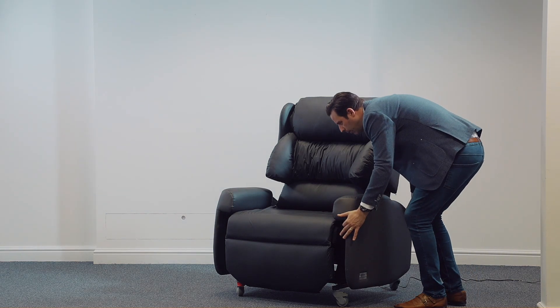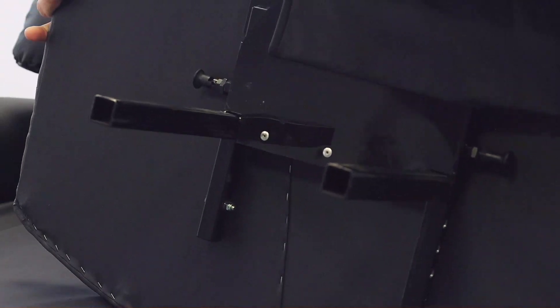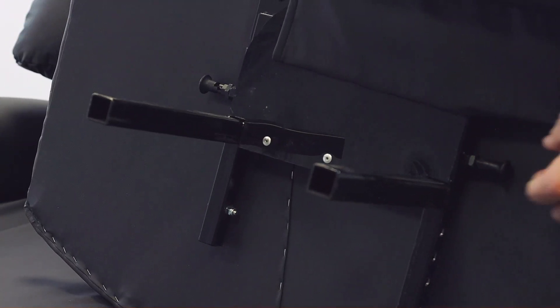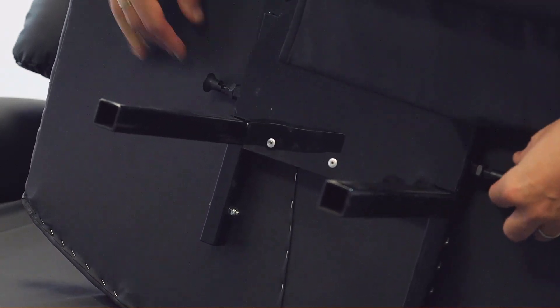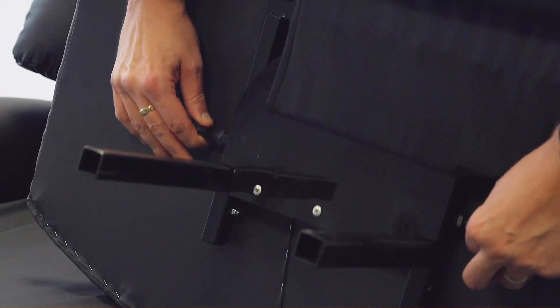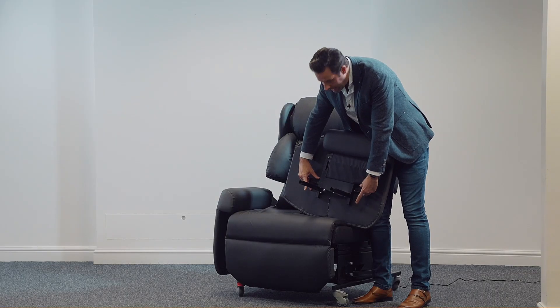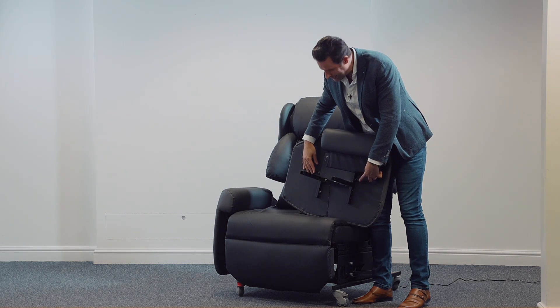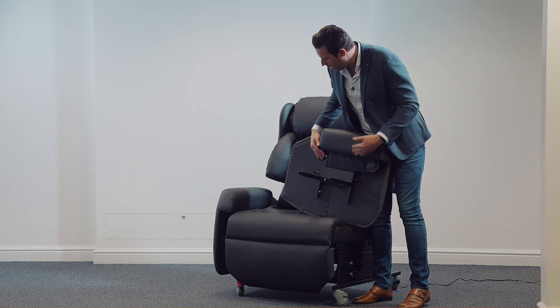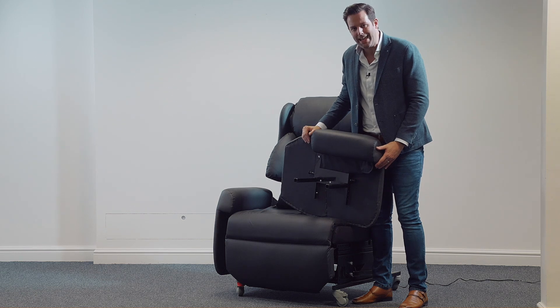The second thing that we are able to do here is remove the arms from the chair on either side, as with the rest of the chairs in the Lento range. Two major benefits: it allows us to adjust the arm height from six to nine inches, and anywhere in between, simply by a pin lock mechanism. And once we've achieved that desired height, we can slip the arm back in.